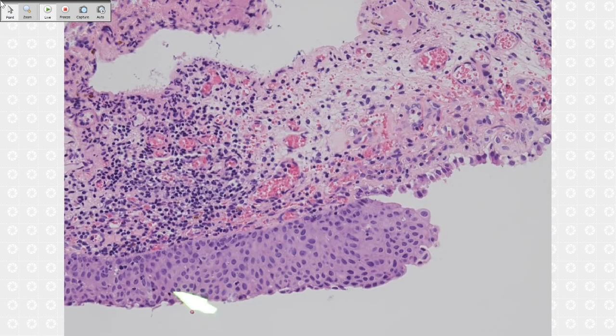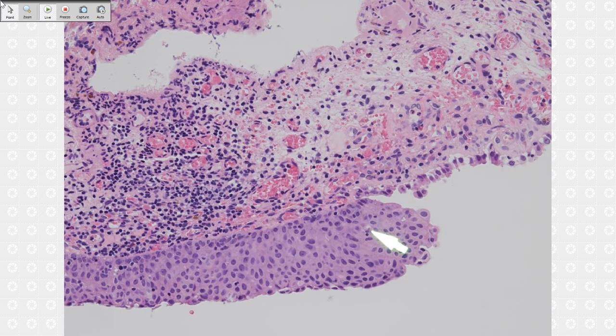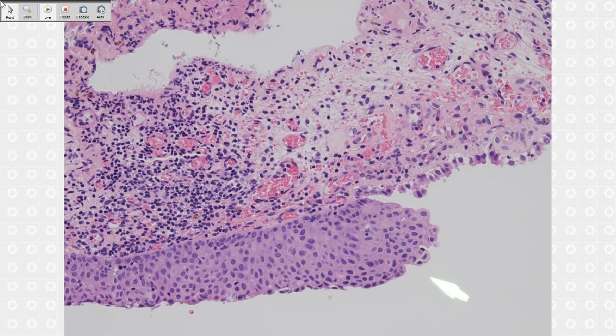You see it's a flat lesion, right? Does it look like high grade? Not yet, right? This is a classic urothelial dysplasia, low grade. If you see here, the cells are starting to show dysplastic change, but it's not ugly enough for carcinoma in situ.